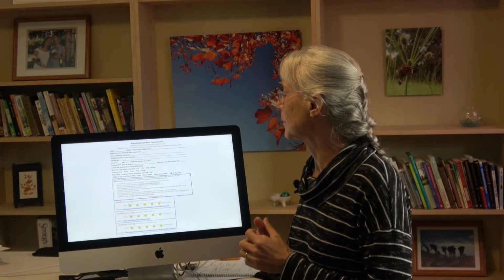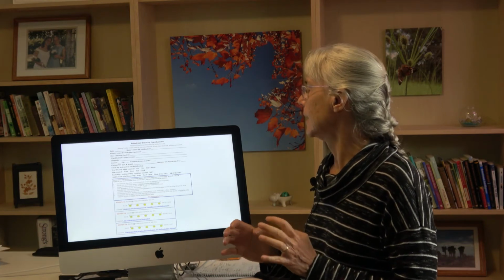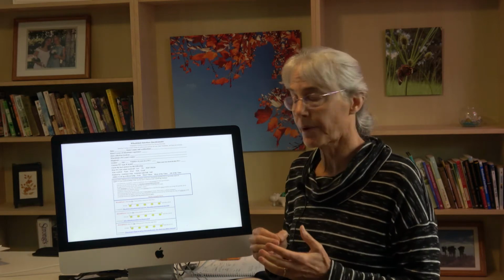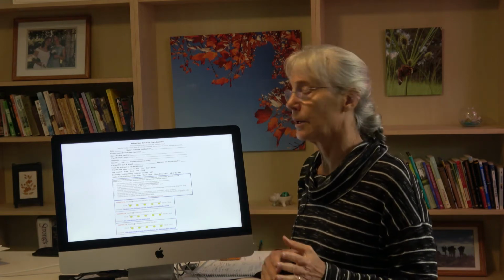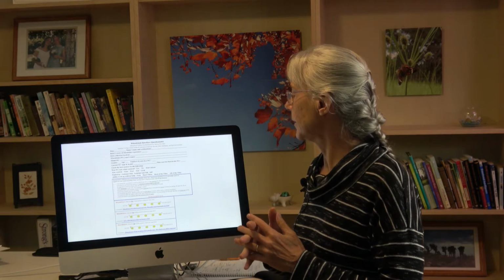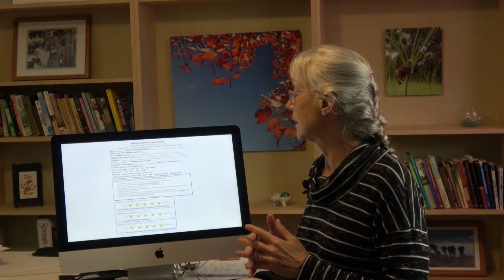See the examples below. Include at least one complete phrase on the comment line to describe the reason behind your rating. Be specific about situations or parts that you feel may be a problem. For mobility questions, answer as the user is most likely to travel either with or without assistance. If a question does not apply to the user wheelchair interface you were rating, do not mark on the line, but write NA in the comment section and explain why the question did not apply.